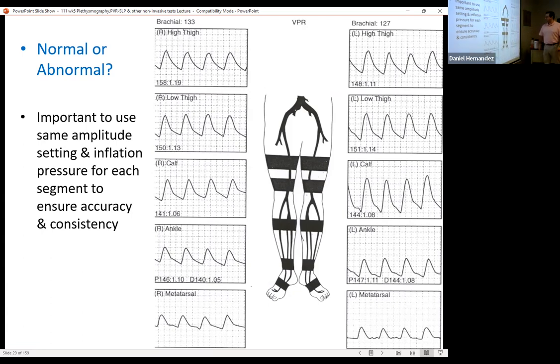But then if that's the case, it would be like that on all of them, right? That right leg, for the first one, maybe it's just not tight enough, or just too much pressure. Does this slide say anything? Does the slide say all normal?